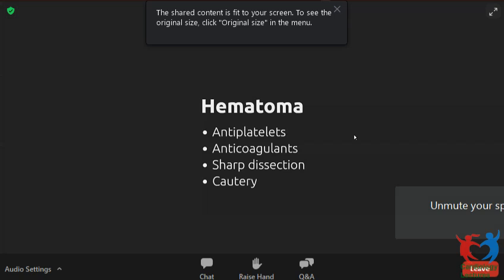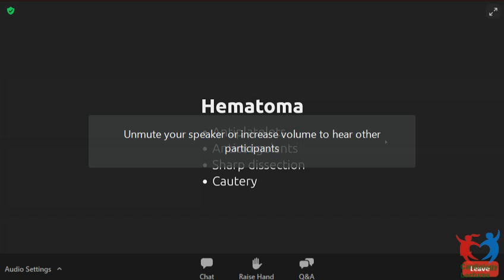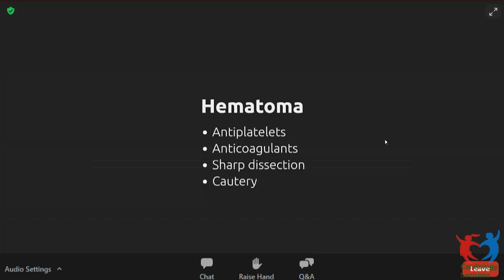Lead parameters have to be checked immediately or after a few days for inflammation to settle to get true values. The way lead parameters are checked, usually, like I mentioned, as soon as the lead is placed, you check. Now, at that point, one thing to remember is for active fixation leads, the threshold takes some time to stabilize. Actually, it takes about 5 minutes to stabilize.